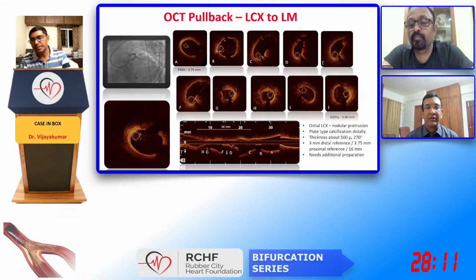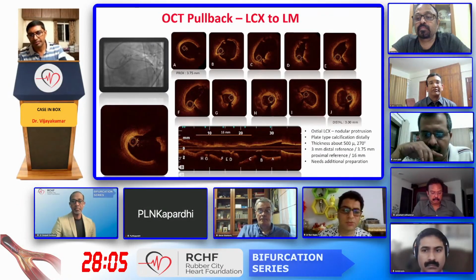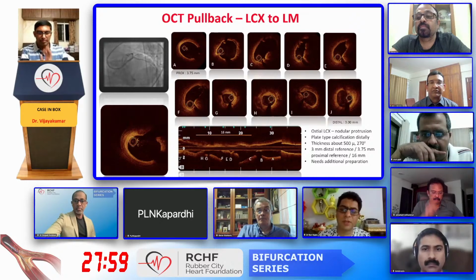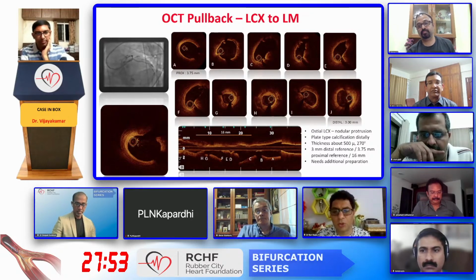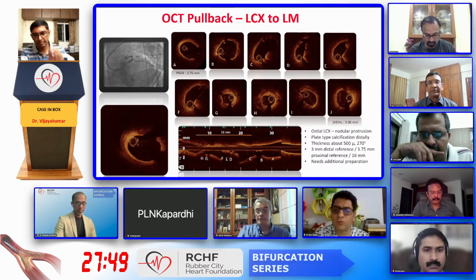Any other comments or any other strategy? You have shown very nice OCT images, and I believe there are 2 findings. One is that the calcium is covering almost more than 50% of the circumference. Another is that there is a big nodule of calcium. So in any case, you would probably require an IVL plus or minus rota.